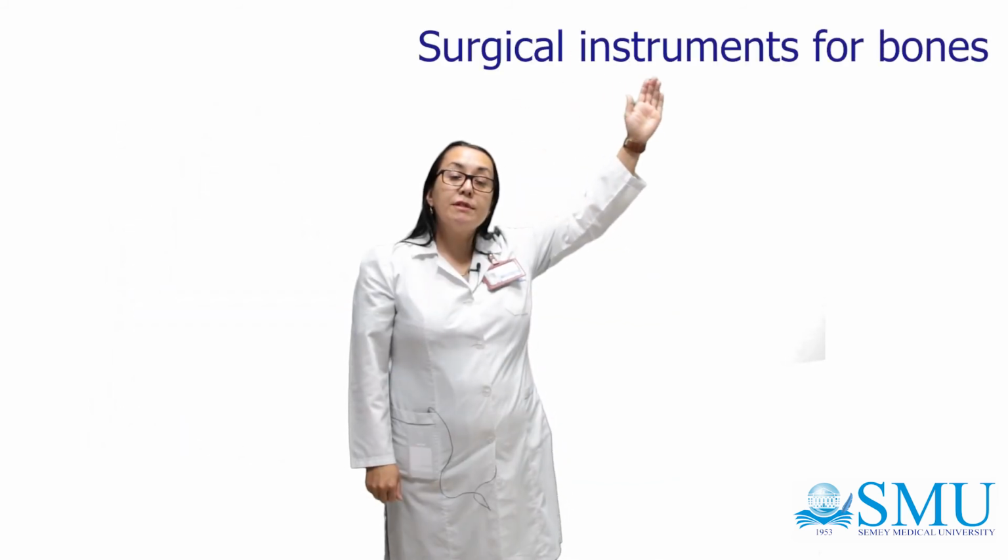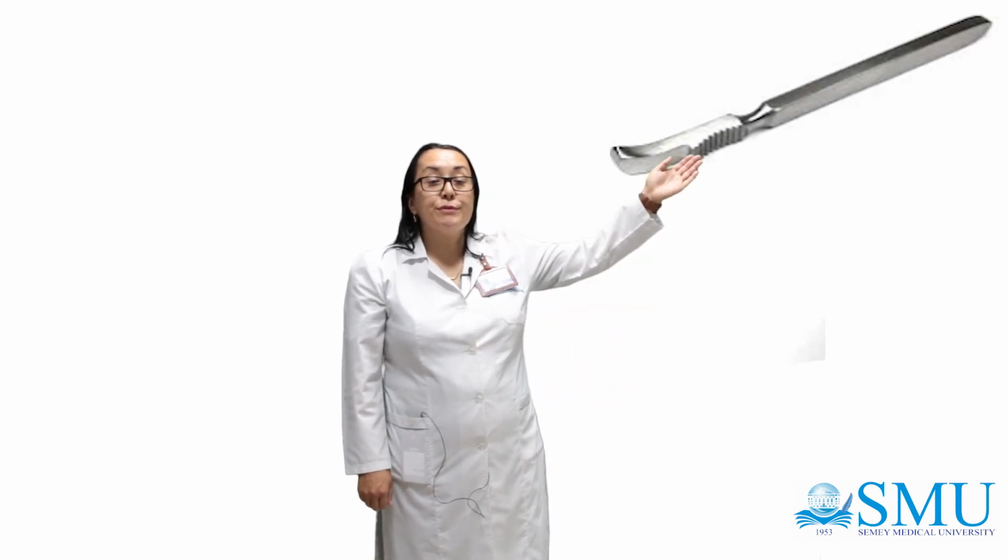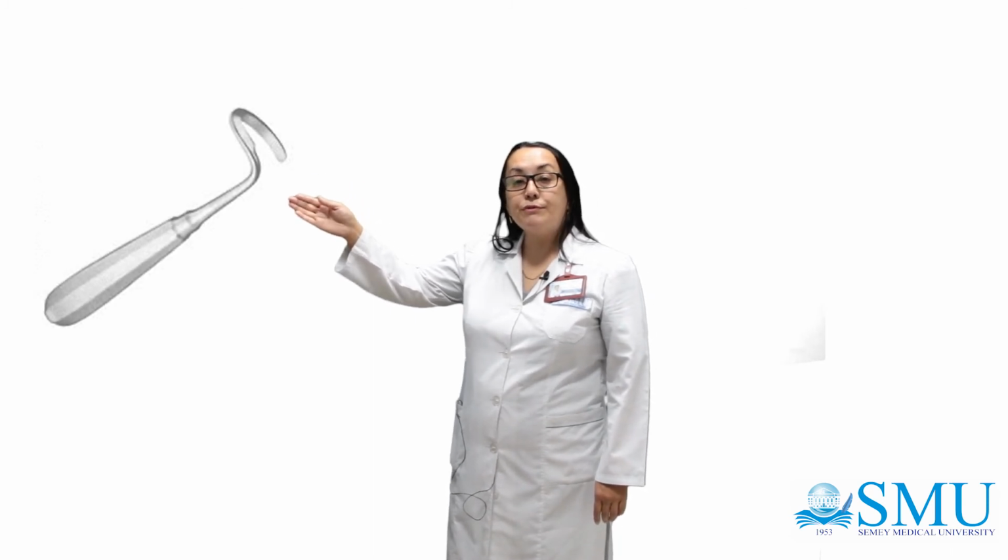Bone cutting instruments. This is Farabeuf's raspatory used for periosteum dissection. Costal raspatory used for ribs.